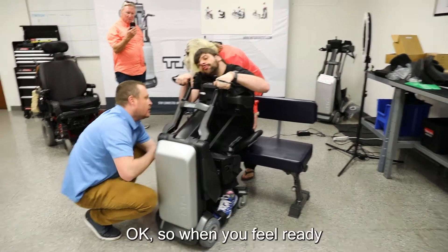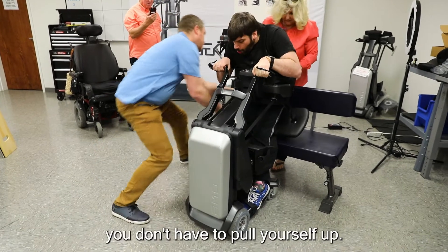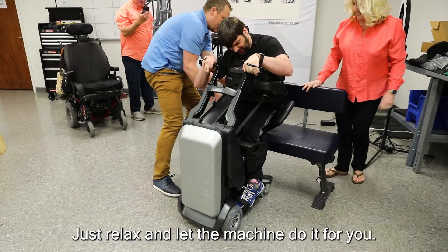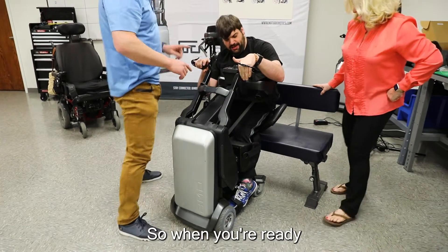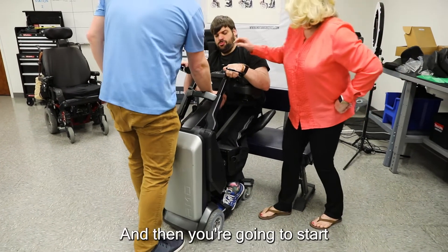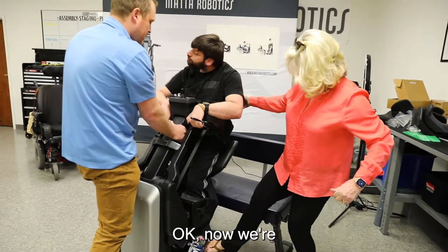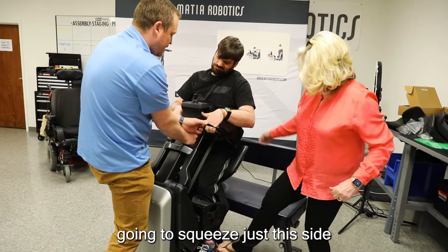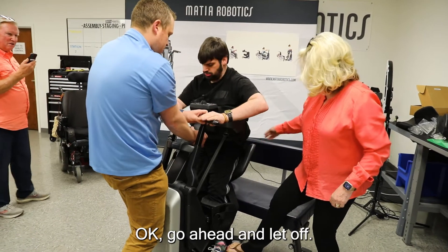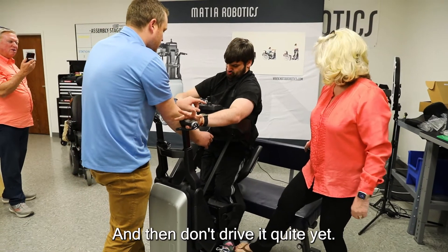You can bring it down just a little bit, right there. Okay, so when you feel ready — you don't have to pull yourself up, go ahead and relax, let the machine do that for you. When you're ready you're gonna squeeze just this side, wait till it's ready, and then start to pull yourself up a little bit. Now squeeze just this side and that's gonna let us move. Let off and that'll just lock in place right there.